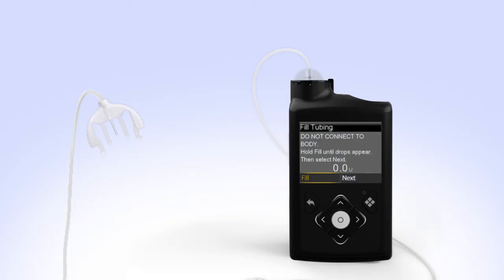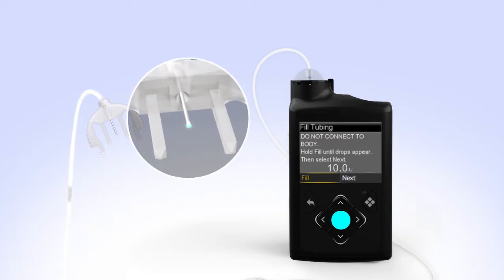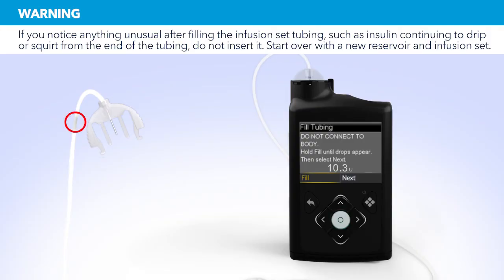Hold the set so that the needle is pointing down. With Fill highlighted on the screen, press and hold Select. The pump screen will display the amount of insulin being moved through the tubing. Continue to hold Select until you see insulin drops coming out at the end of the needle. After you see the drops, release the Select button. Hold up the tubing to the light to check for air in the tubing. If you see air, once again press and hold Select until the air exits the end of the tubing.